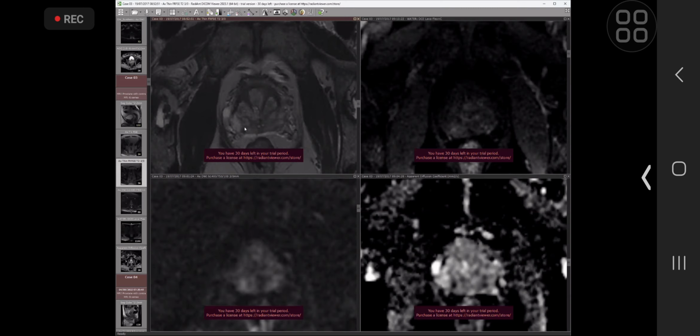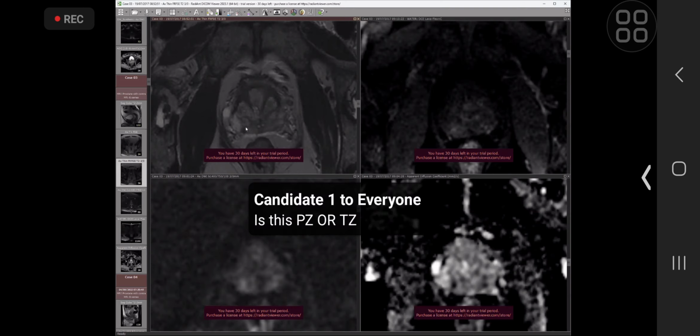I'm not specifically talking about prostate MRI now, but a good thing to do, while you're describing your key findings in, for instance, a plain film, is to be looking around the rest of the chest X-ray or the abdominal X-ray to make sure that there isn't anything else that you may have missed that might be relevant. So satisfaction of search is something to be aware of, particularly in exam settings.